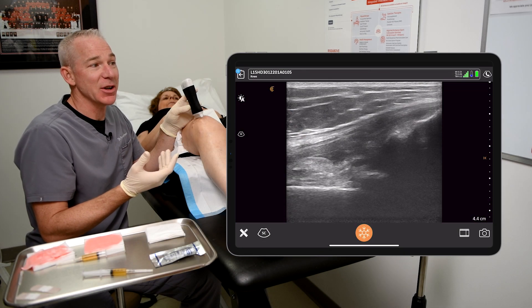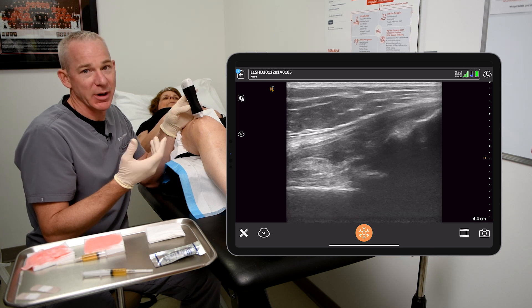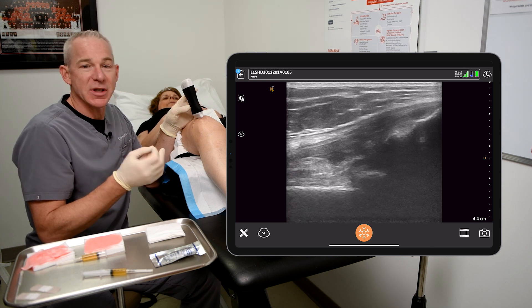I've actually made my job really, really difficult, and without ultrasound this would be highly challenging. With ultrasound, I'll walk you through it.